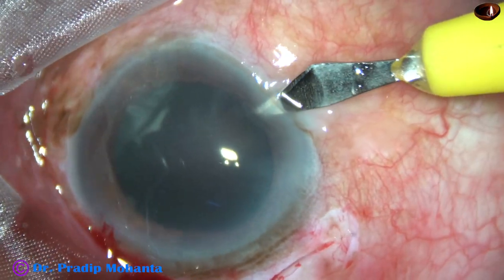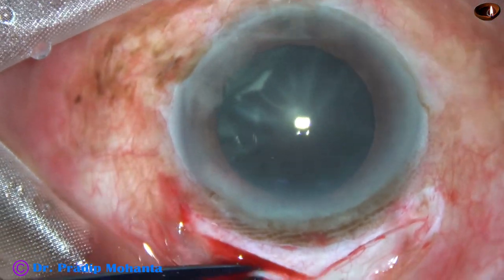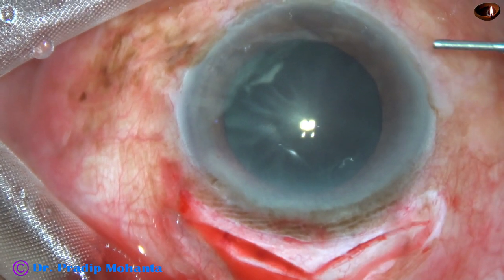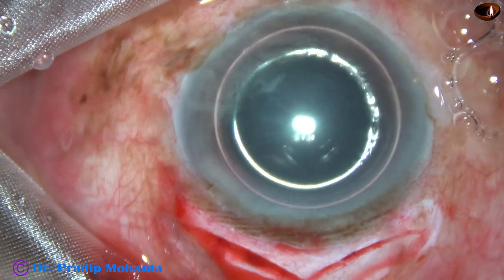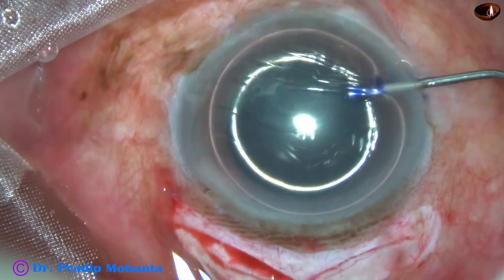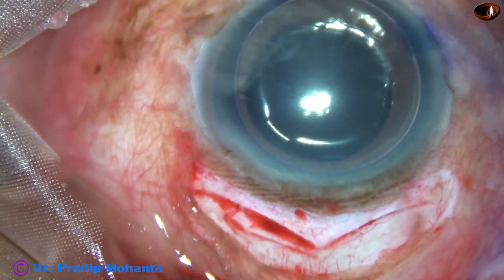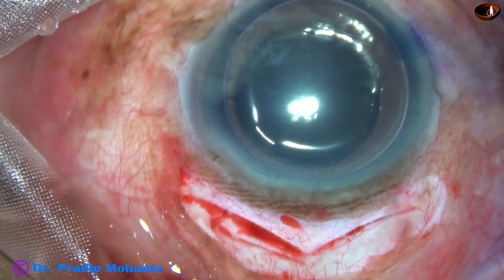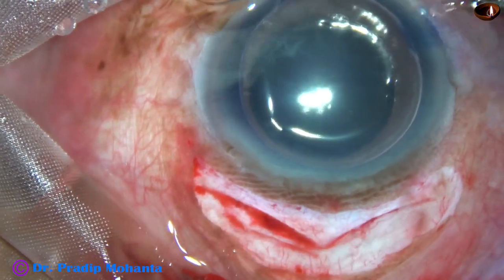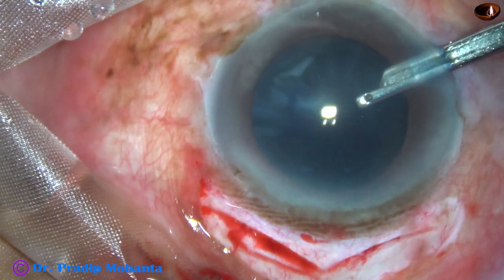Now this is a sideport at around 8:45 o'clock. I am going to inject an air bubble. Beneath this air bubble, trypan blue dye is applied over the anterior capsule. The cataract is black so we will not get a lot of contrast, but whatever contrast we get will help in doing capsulorhexis. The dye is then washed out.